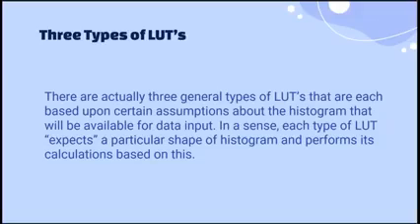Again, you have two LUTs during image processing. The first LUT, or lookup table, is the one that we have acquired after the patient has been x-rayed.